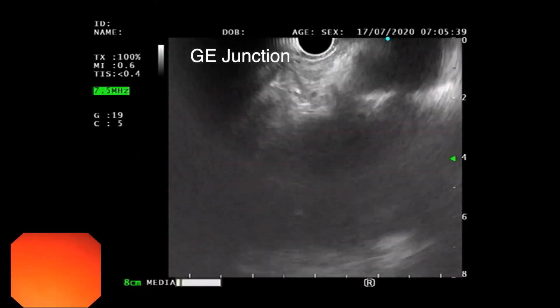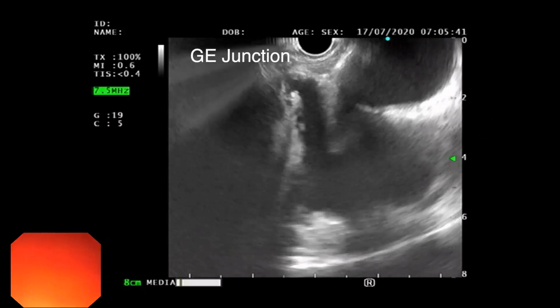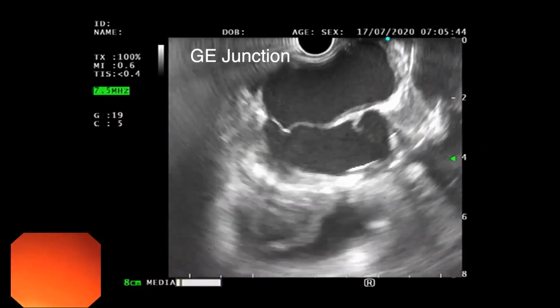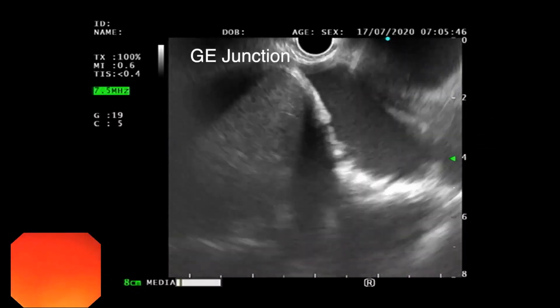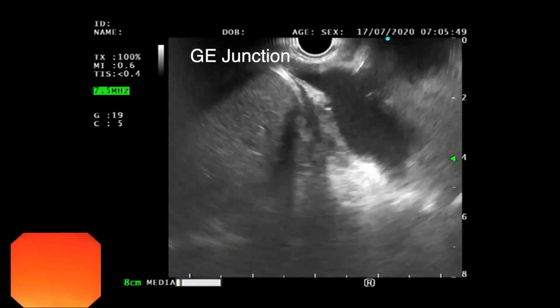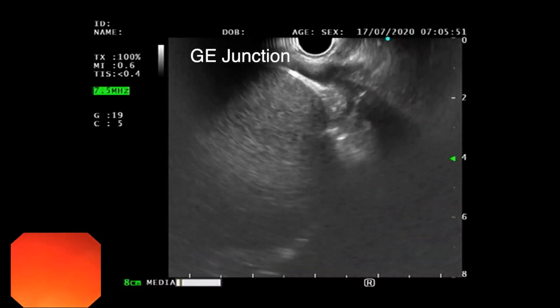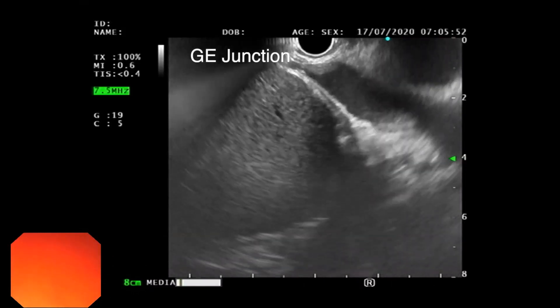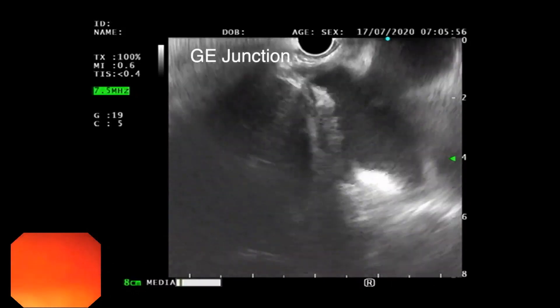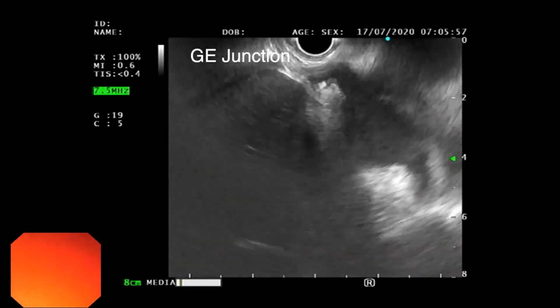Here you can see that the pulsatile structures are cardiac chambers, and here you can notice the intra-hepatic IVC opening into the right atrium.